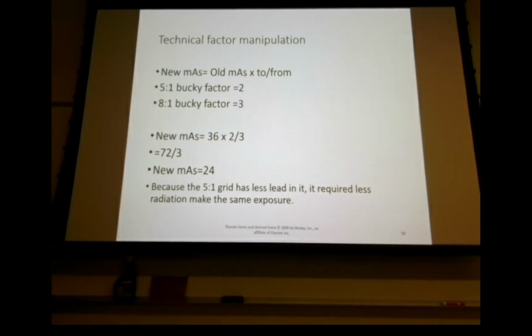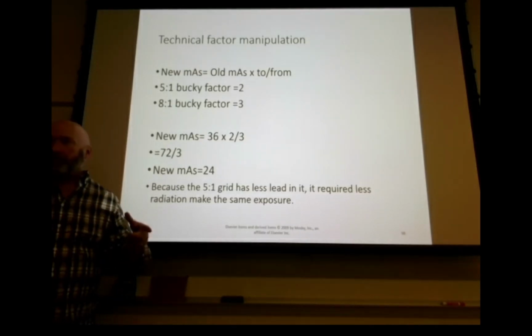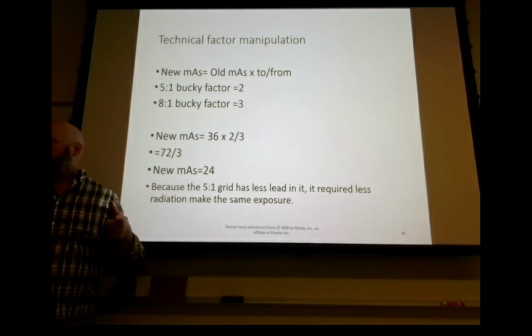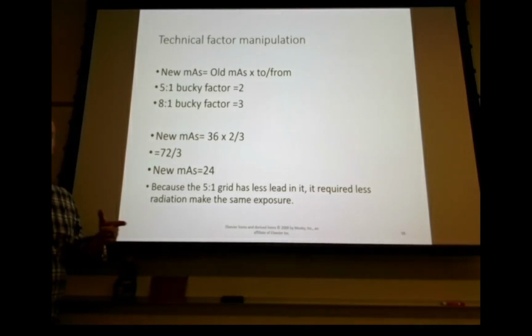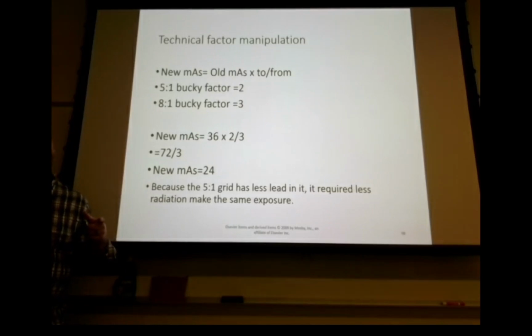So what a virtual grid is, is a complete absence of grid. So what you have in your image detectors in DR is the ability to not just count the X-ray photons, which is all screens of films and CR technology did, but it can detect what energy level that X-ray photon was.